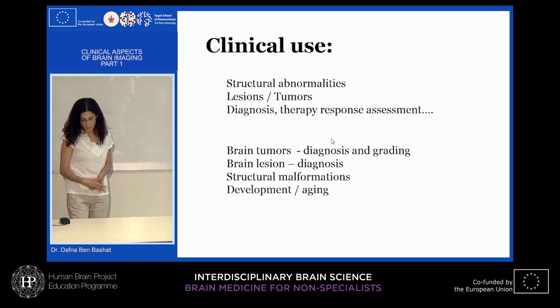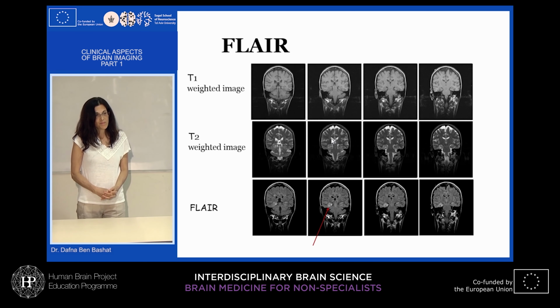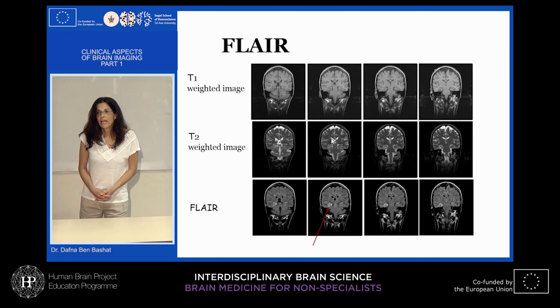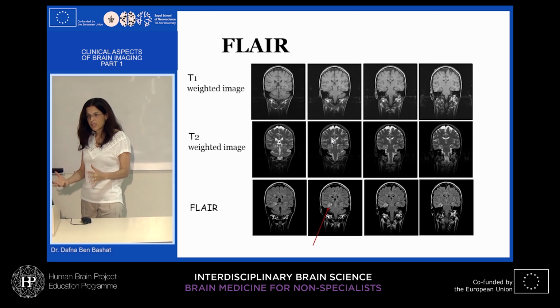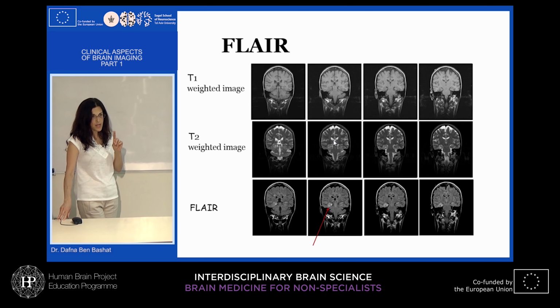Question? Yes. How much do radiologists these days still use their vision to say whether there is a problem, or do they take it to some kind of quantitative methods? This is really the frontier in imaging, to have tools that help them. I know in breast imaging there is software that you send the images to, you get it back, and it helps the radiologist. It will never substitute them, but it really helps.